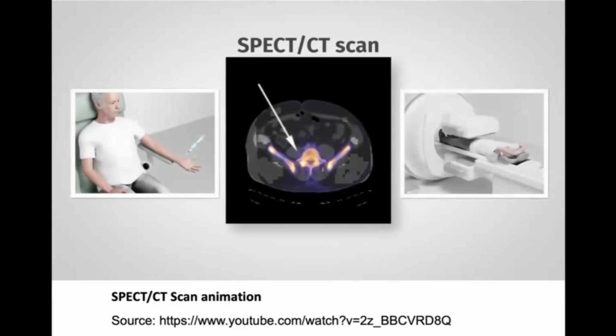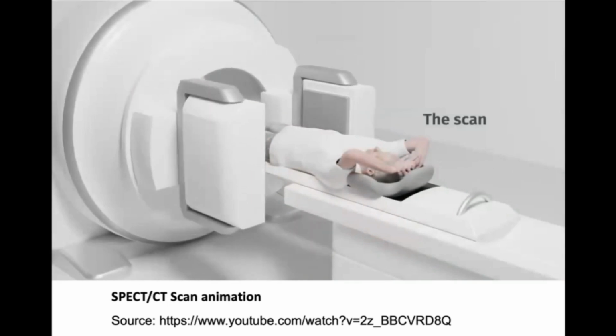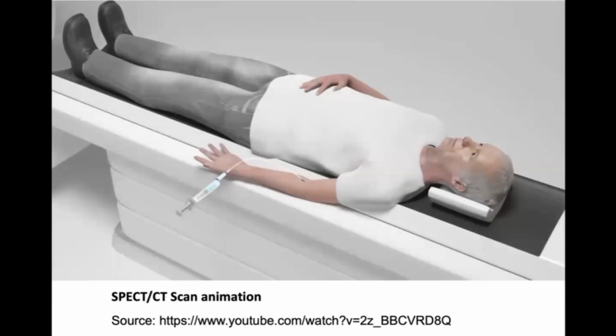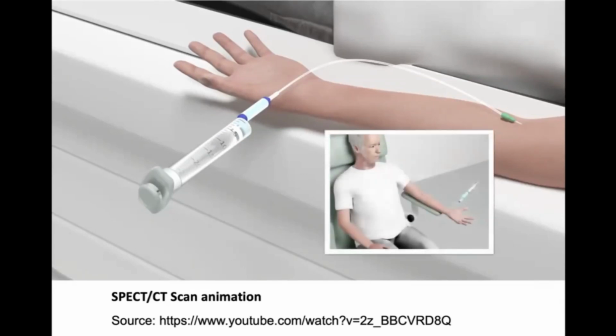A SPECT CT scan is undertaken in two parts: the administration of the tracer and then the scan that shows how the tracer behaves in your body. A nuclear medicine is generally administered through an intravenous injection, but can also be inhaled, swallowed, or injected in the skin. What study you have will decide how the tracer is administered and whether it is done lying down on the scanner or elsewhere in a chair.